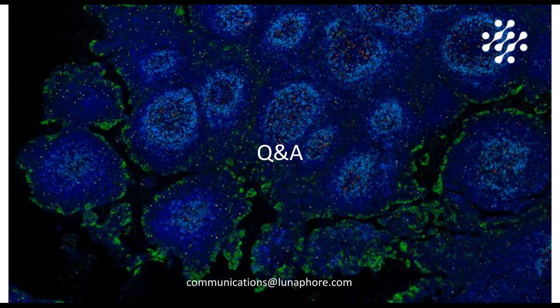I would say that in general, for high throughput applications, Leica Bond RX remains the standard. But if you're looking for a device that has very low turnaround time, if you have only a few precious samples to stain and you want to move fast in your project and optimization, then LabSat can offer you results in a very timely manner. And I think that's the main asset compared to Leica, but also to other available devices.